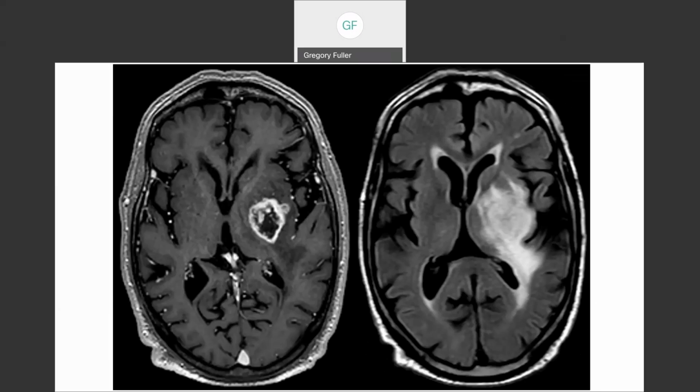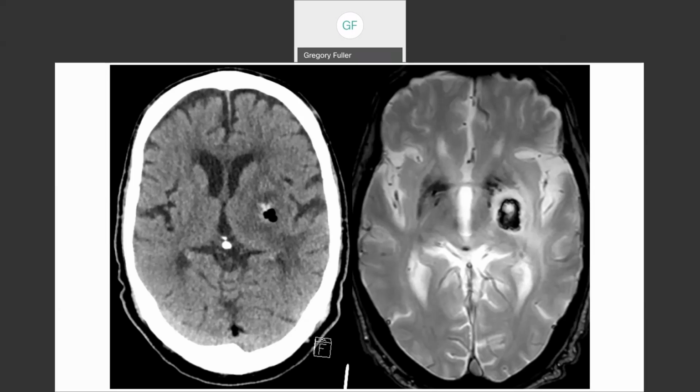Okay, hypothesis. Maybe, on another cut, on the coronals a little more anterior, the tumor was involving the left frontal lobe and they decided it would be safer to take a bit of left frontal lobe. Is that what happened? No, we always check the post-op. You can see the post-op CT on the left-hand panel, and as you can see here, the air bubbles are right in the center where the lesion was. And then here's the gradient echo, the T2, and you can see that's the biopsy site. We confirmed it, we proved it, we did our due diligence.